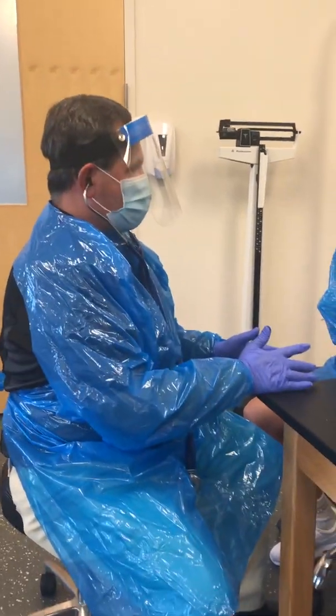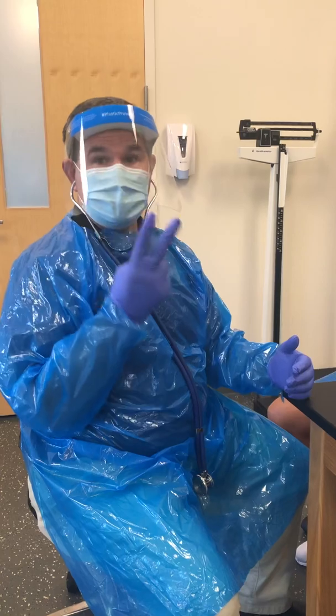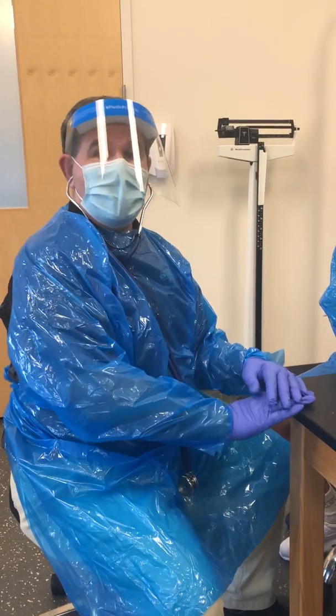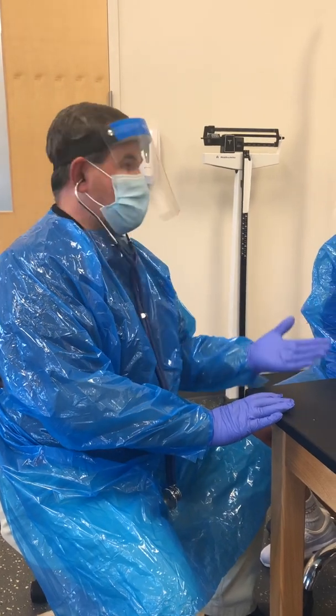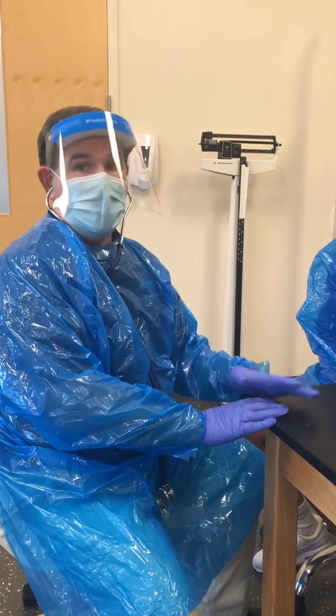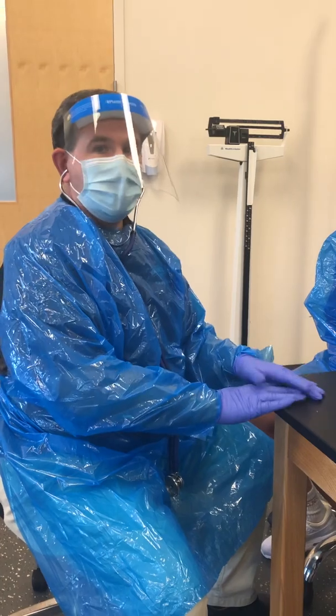We're going to rest 1 minute here. With her permission, we're going to take it for a second time. Now I'll have the ability to average the 2. When we average the 2, there is a potential that her systolic blood pressure could be at an odd number, but we never read an odd number.